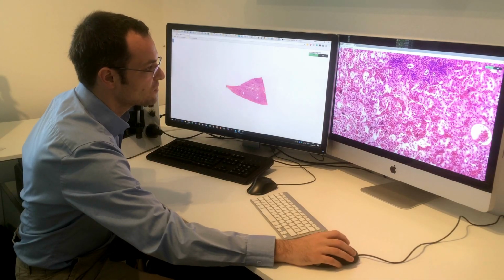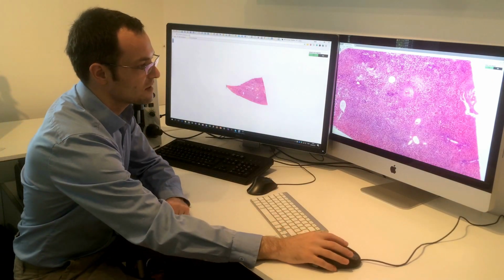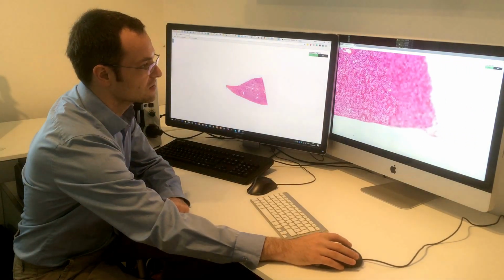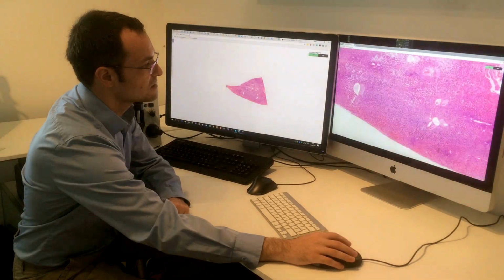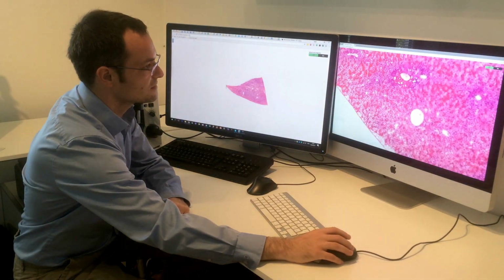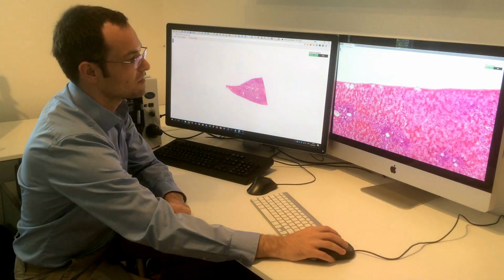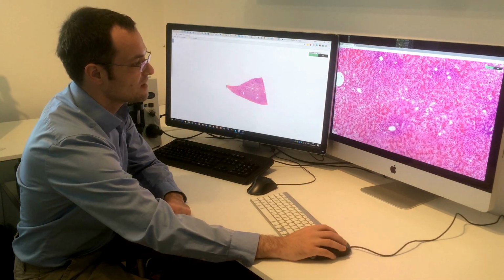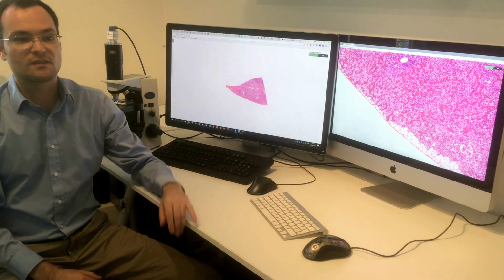And now the remote viewer, this image is transferred via the internet. The remote viewer can view this slide in the full 10x magnification. And you see that it takes a little bit of time to load the image tiles here. Here it's blurry, for example, on the right, and now it's sharp everywhere. Now it's loading the other tiles. It would be the same speed if the computer is located on the opposite side of the world.